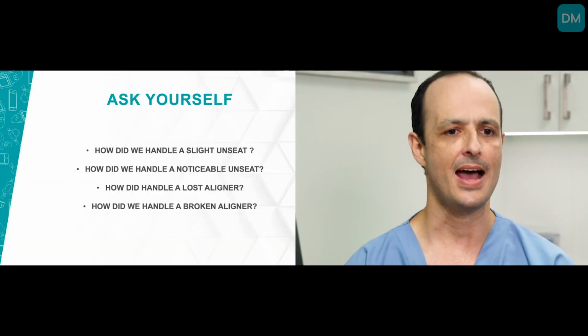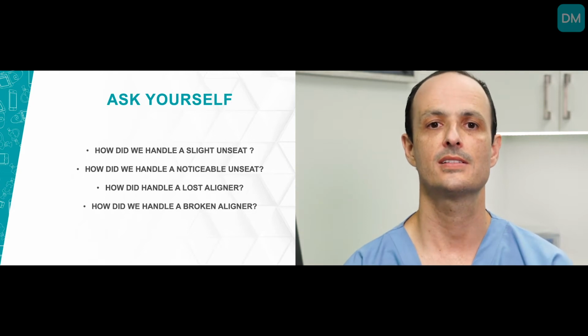I'm going to be talking to you about how to create patient management flowcharts for dental monitoring implementation throughout your office. Now, what you need to do, set some time aside, maybe a lunch break, sit down with your dental monitoring champion and maybe your manager, whoever's involved in the creation and implementation process in your office, and sit down and ask yourselves the following questions.